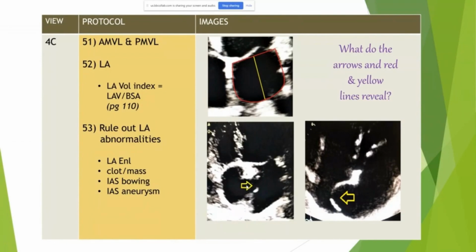When we measure that LA size and the LA volume, we get what we prefer in echo over the linear measurements, because it allows us to more accurately assess that left atrium chamber. So for doctors and cardiologists, the relationship between the person's particular cardiac disease is stronger.